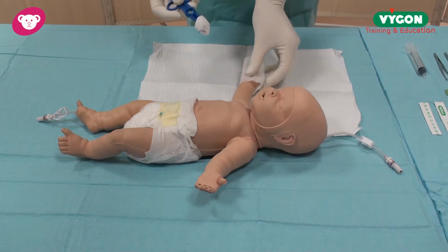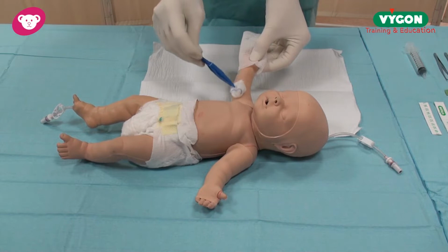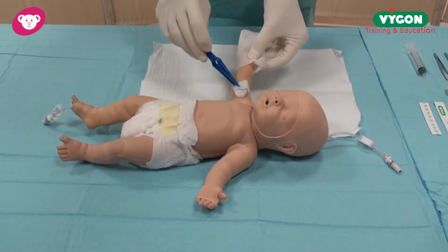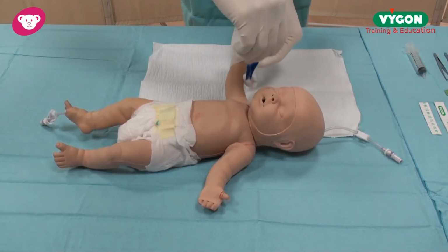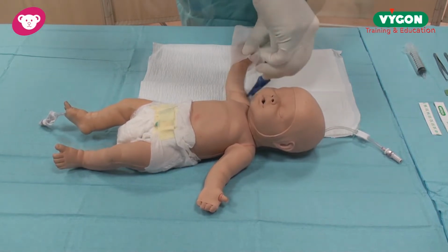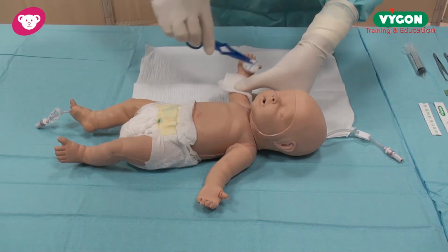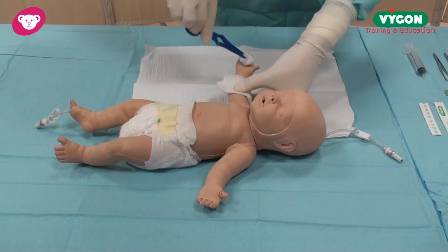I will hold the baby's hand with a sterile swab and then start to clean the baby in an up and down motion. When I first trained, we used to do this in a circular motion, and making sure that I move around to the back of the arm, and we will do that 2 or 3 times. Now that I've cleaned the entry site, I'm now going to clean very carefully the baby's hand. And I will again do this 2 or 3 times.